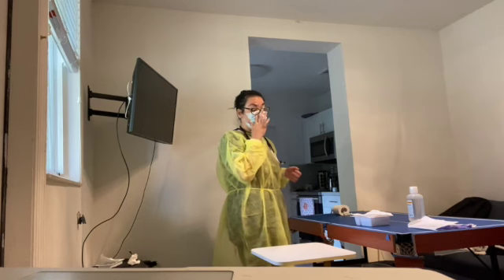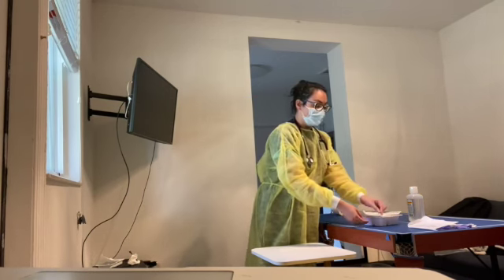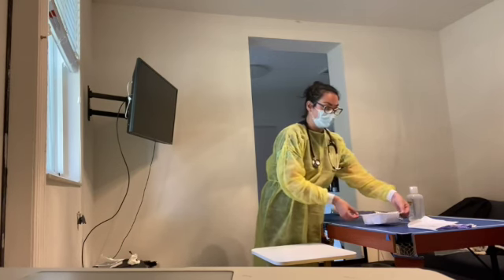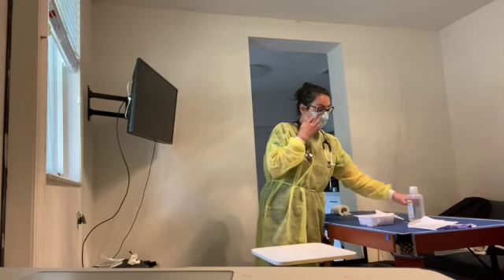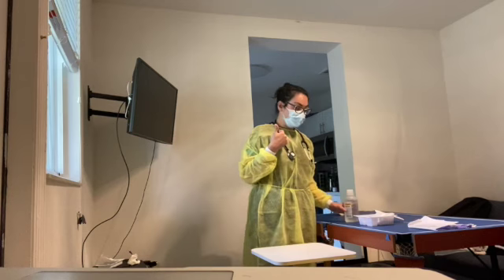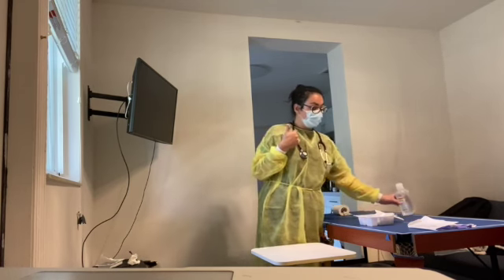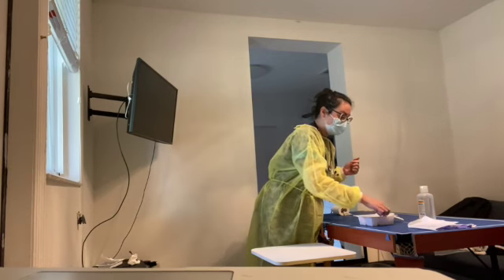So I'm going to move on to my supplies, and I'm going to open up my tray and place it using the 1 centimeter border here. At that point, I'm going to check my saline solution, make sure that it's not expired. It's not expired. I'm going to not cross my sterile field, and I'm going to pour some of the saline on each one of the little trays. At this time, I'm also going to grab the sterile draping on a 1-inch margin and place it in my sterile field.